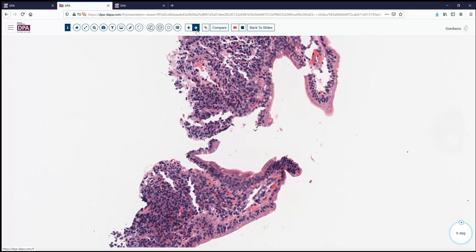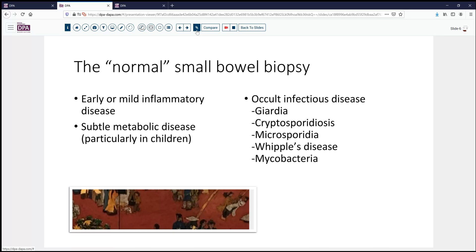This case raises the question of what do we think about when we're looking at what appears to be a normal small bowel biopsy. Certainly age group and setting make a big difference in terms of what we may be thinking about. Early or mild inflammatory disease — whether that's Crohn's disease or other inflammatory diseases. Sometimes, particularly in children, there may be some subtle metabolic disease which can look relatively normal, such as disorders of glycogen metabolism, tufting enteropathy, and things of that sort.